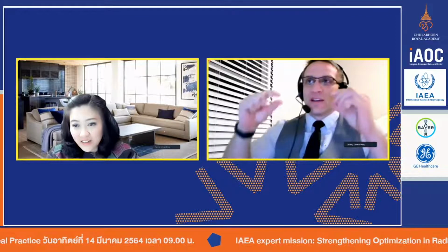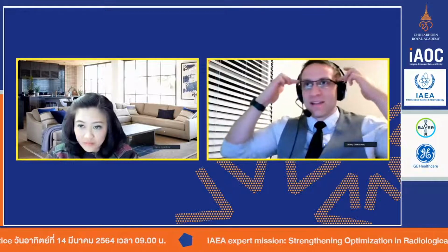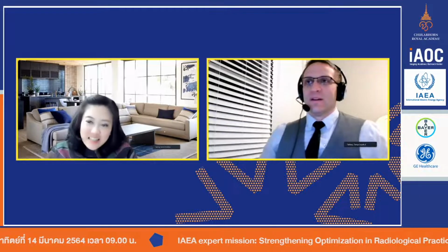And if we're using a pitch less than 1, with about 20 millimeters, it's not as large a beam width, but it gives you the best opportunity to tailor the dose from the thinnest part of the head to the thickest part of the head. So yes, we're getting really good dose modulation, but now the scan will take more than a second, maybe 2 seconds, because it goes really slowly as it tries to modulate the dose all the way down through the head.